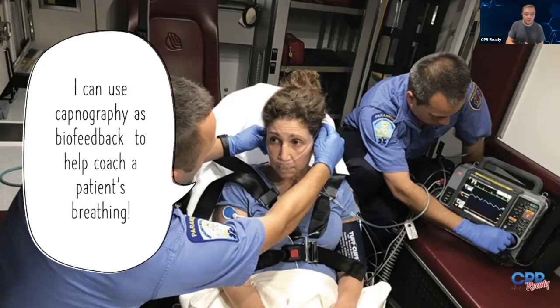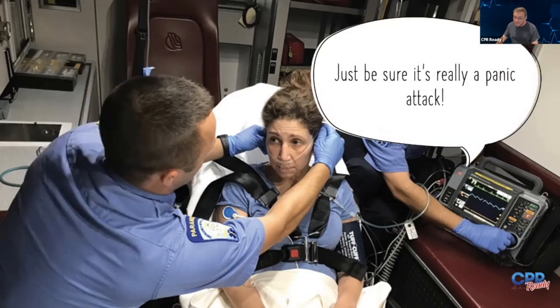And you tell them, okay, we're going to work on your breathing. This is how you're going to feel better. Watch this number. You want this number to be between 35 and 45. And look at this waveform. This is your breathing. So watch your breathing, slow it down, watch the rate, and they can start to use it as biofeedback to have something to focus on and coach their breathing. And this, in studies, has been shown to be very, very effective in helping patients that are having true panic attacks regain control and start to get back to their baseline. But of course, be sure it really is a panic attack and not a pulmonary embolism, right?